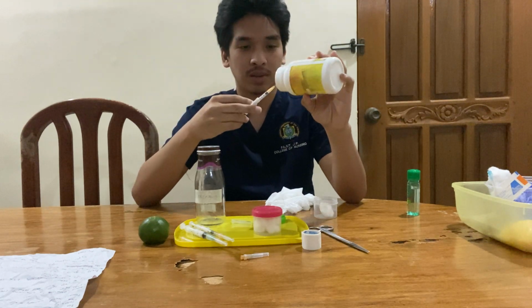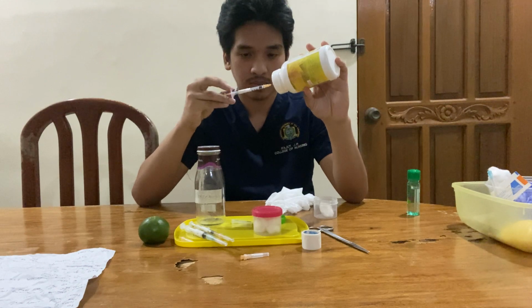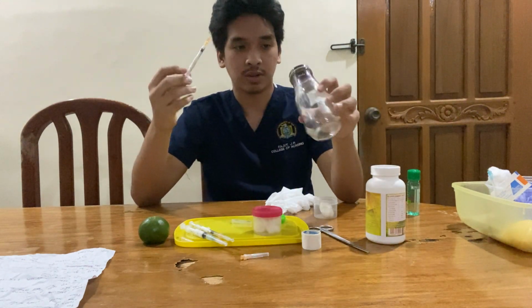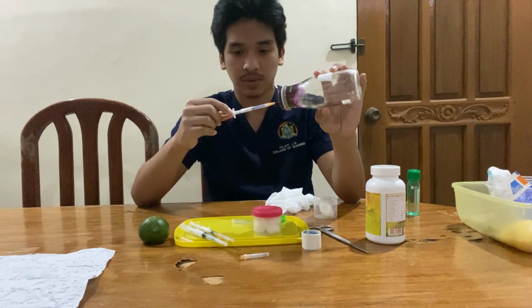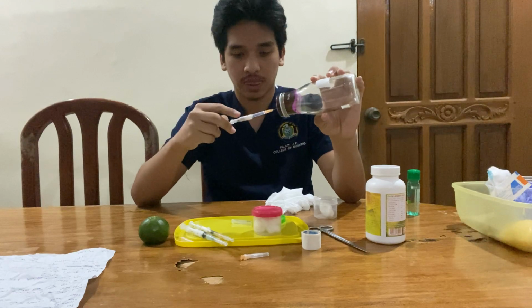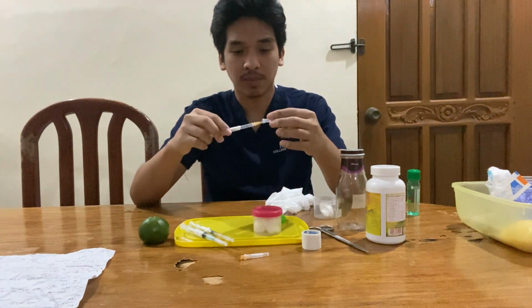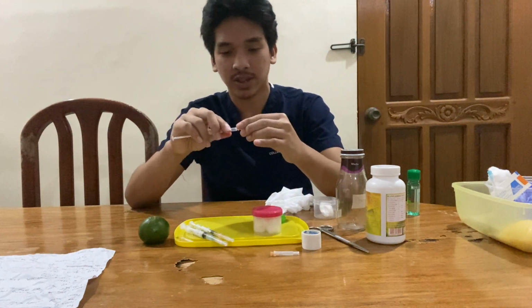So the cefuroxime 0.1 ml. And 0.9 water. Assuming that I have gotten the medicine, I'll put back the cap, and put the one for injection.